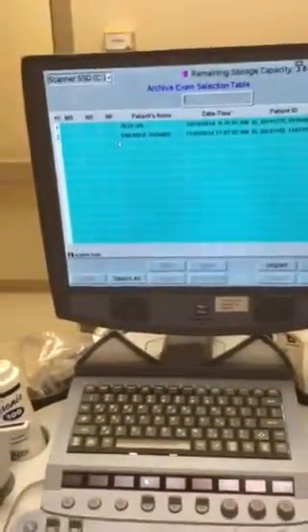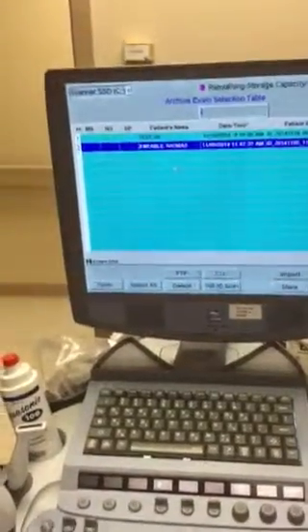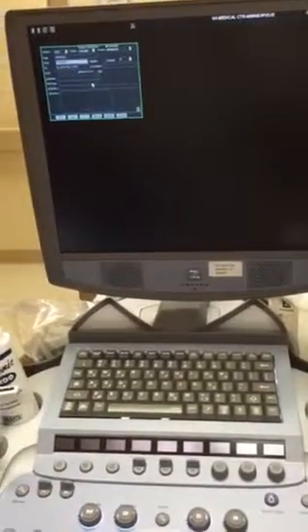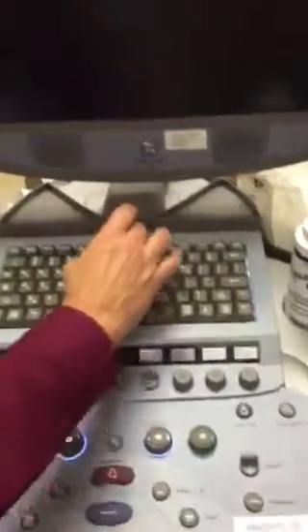He's one of ours, isn't he? I think I might have used it to vein map him. Let's see if we can scroll to open the data on it. Hit set. No, I think it's just his information you put in. Okay, well, we can delete that.